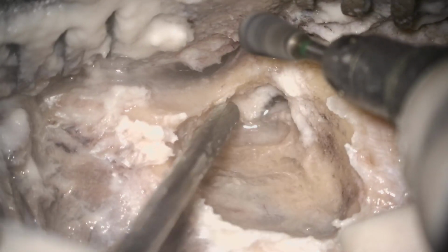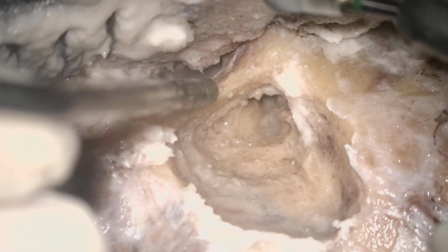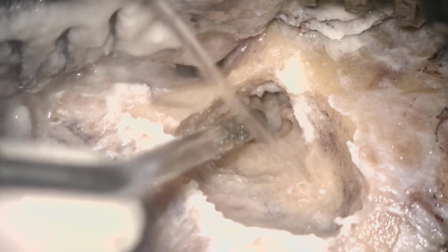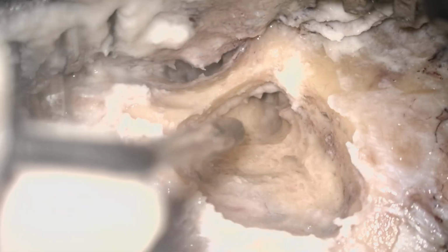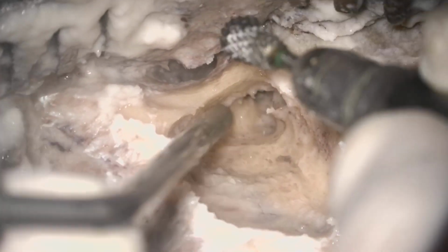So look, this is the canal wall, and look at the position of the microscope. It should be vertical on the external auditory canal, so that you can visualize the external auditory canal and the mastoid cavity. Both the cavities should be visualized from the head-on direction, so that you can assess the thickness of the external auditory canal. Otherwise you cannot judge.